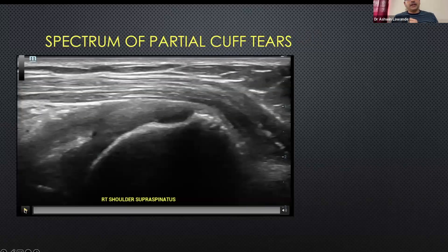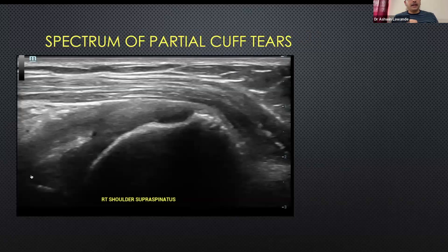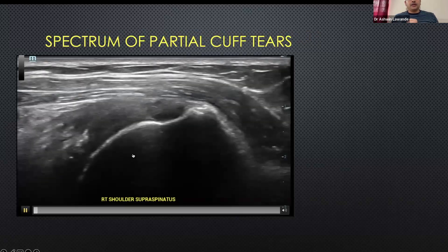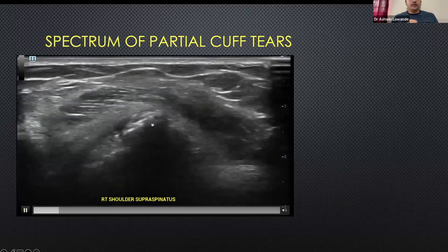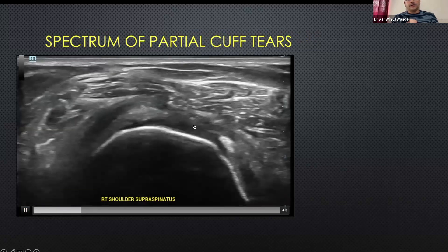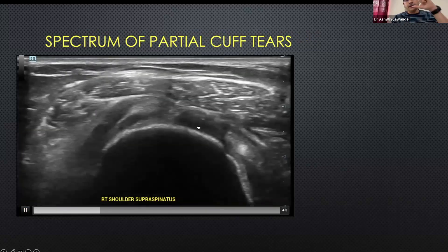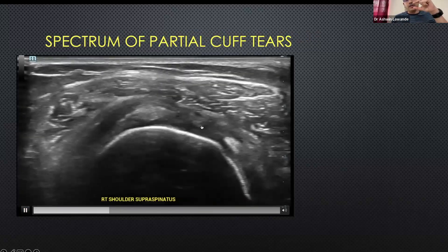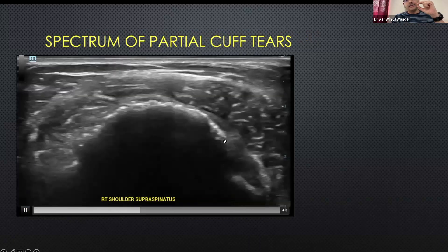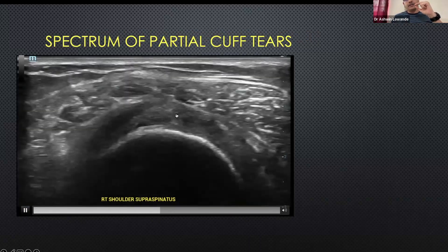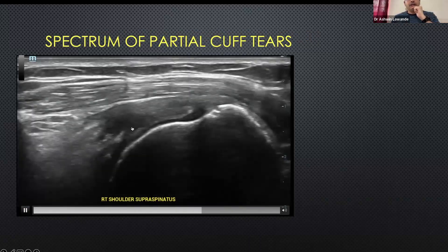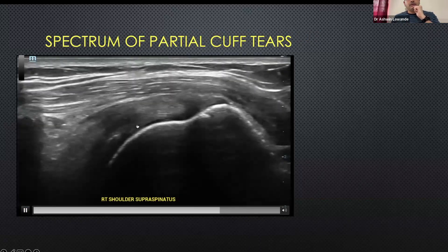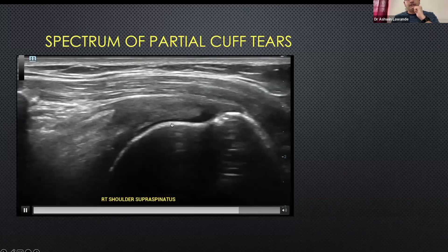This is the first case of a partial thickness tear with shoulder pain and weak abduction. In the short axis, you see fraying of the articular surface fibers and reduced height of the tendon. That's the biceps, the infraspinatus, and the supraspinatus in short axis showing the subtle articular surface tear going along the articular cartilage.